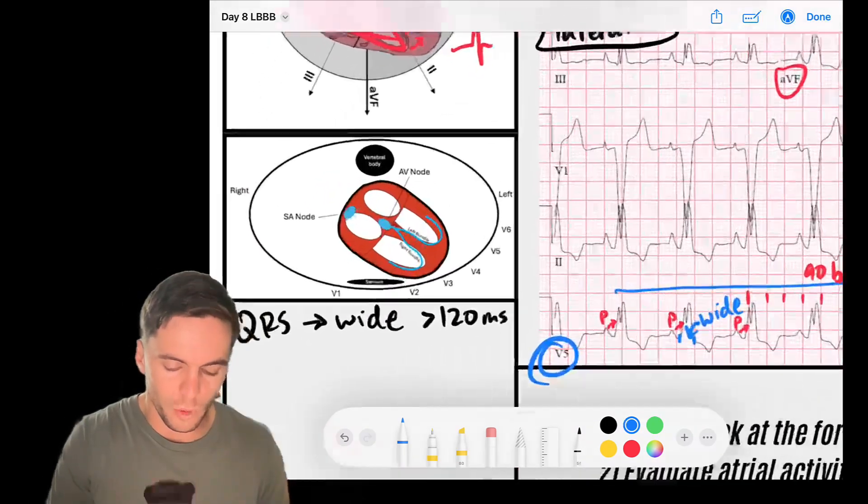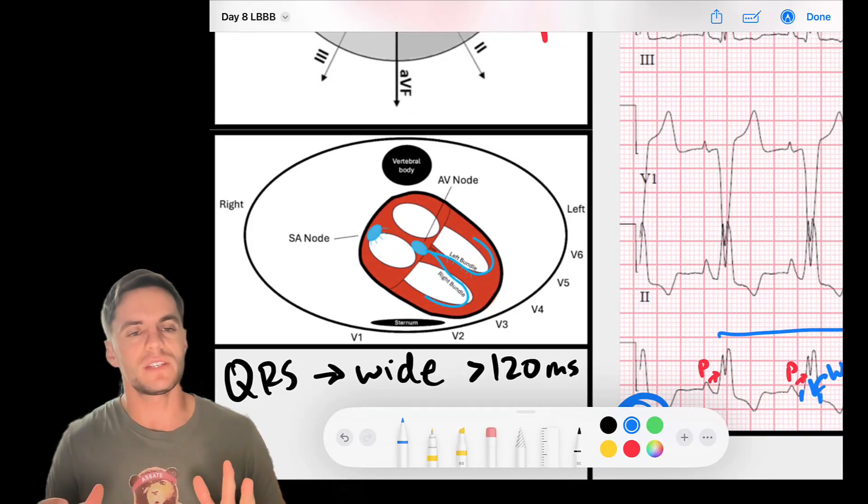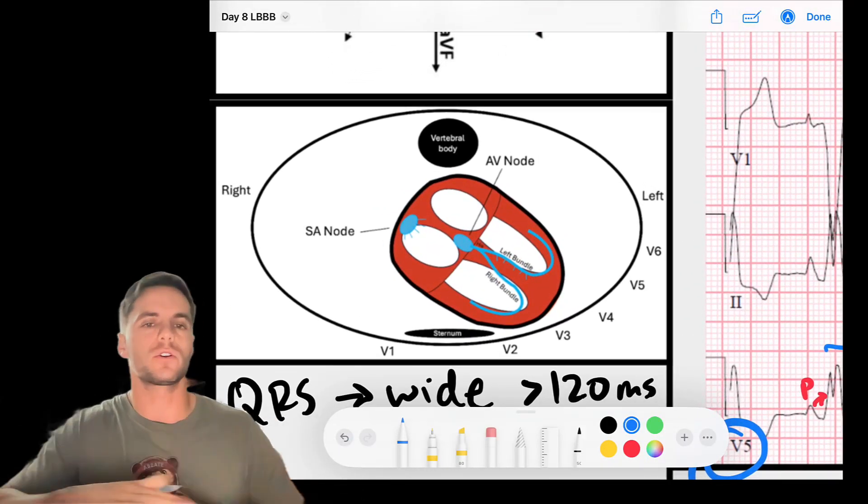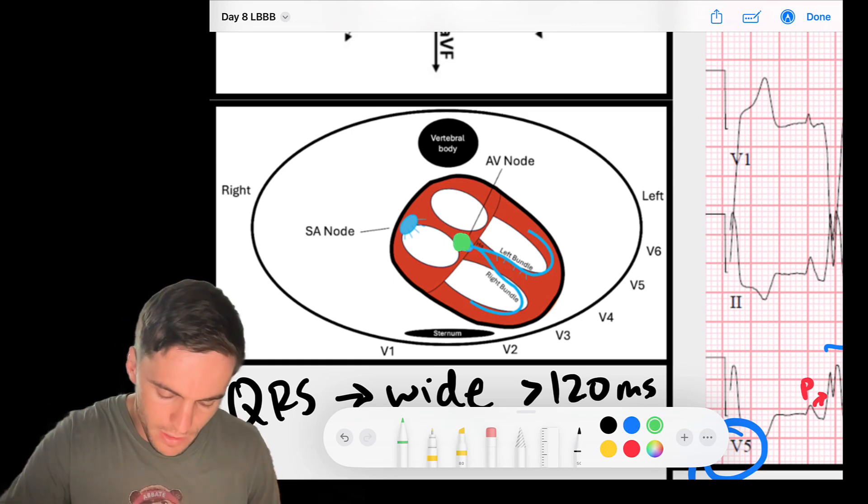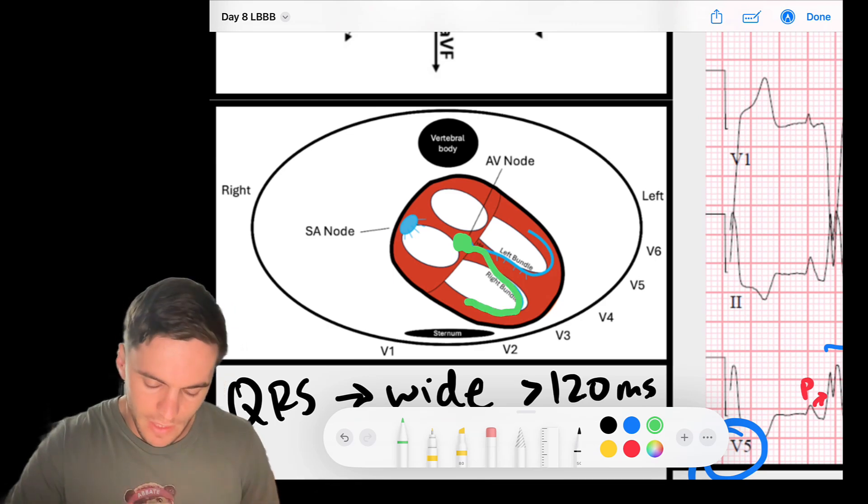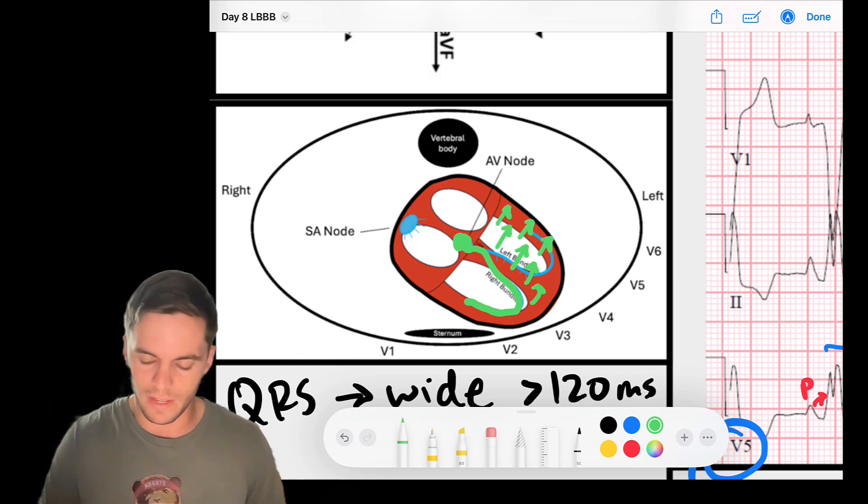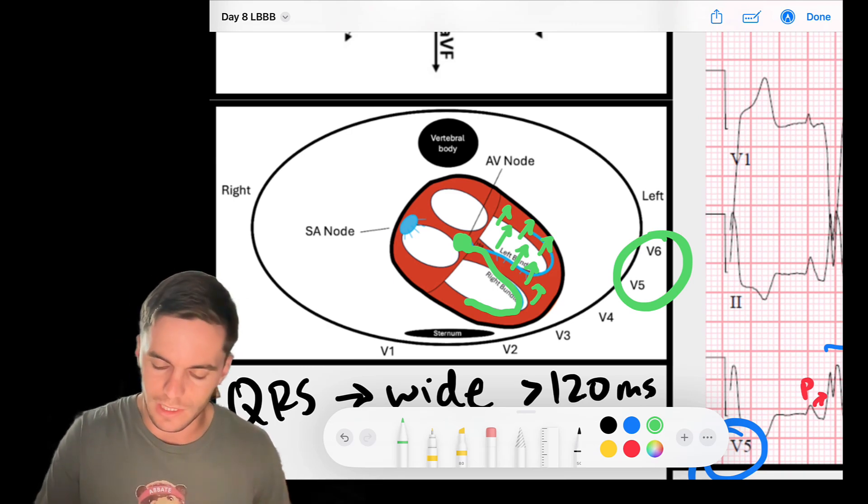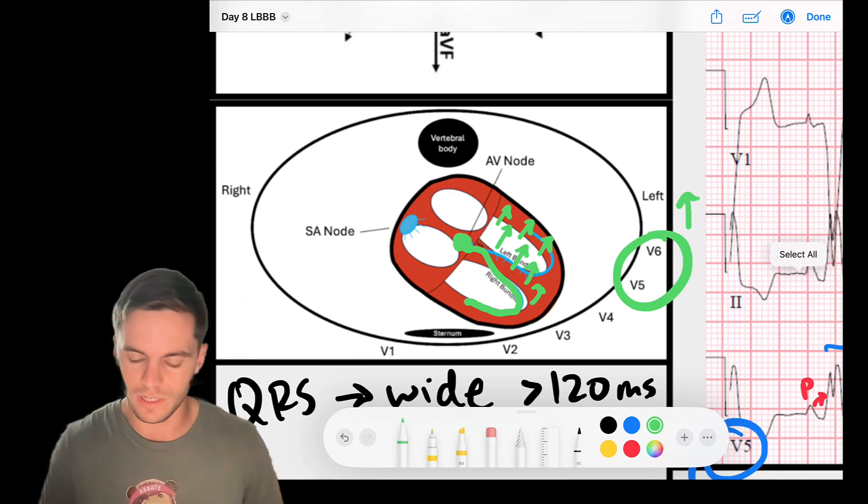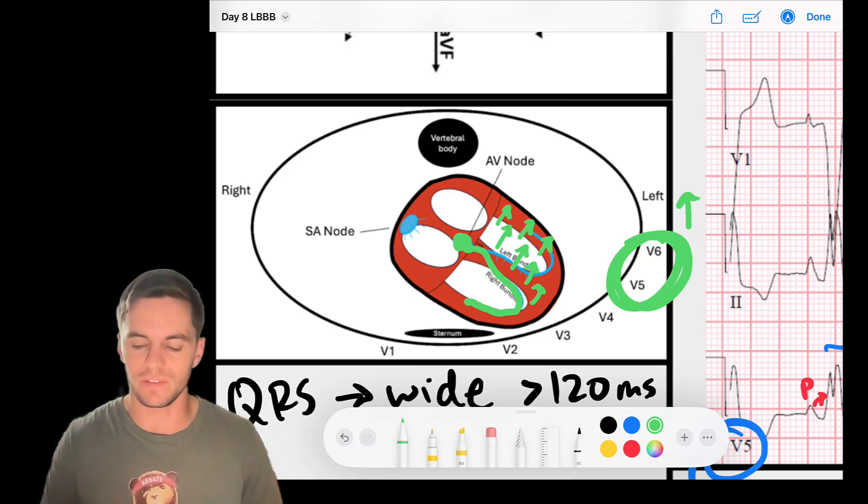Now remember our precordial leads, leads V1 through V6. If I look here, this is more of a transverse plane across our chest wall. Remember that the same thing is going to happen. We're going to have signal coming from the AV node, it's going to pass nicely down the right bundle. And then it's going to have to slowly, cell to cell, head to the left. Well, what are our lateral forces on the left? V5 and V6. So we should also expect late positive forces in V5 and V6, very similar to leads 1 and AVL.